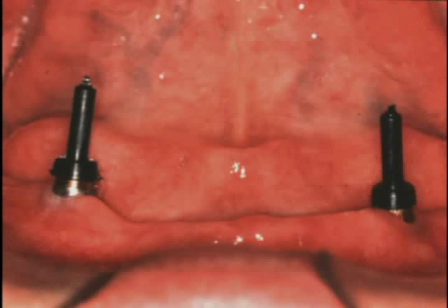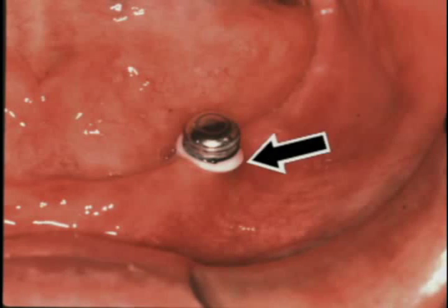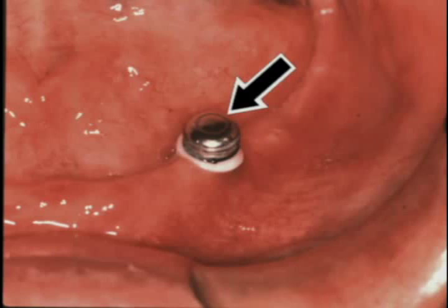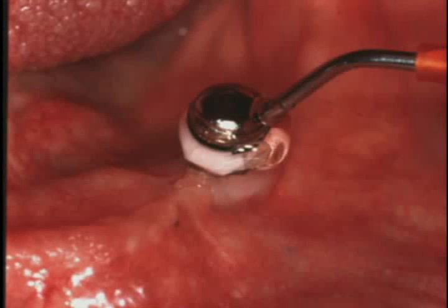When placing multiple attachments, snap a parallel post into each seated locator abutment to check parallelism between implants. For this patient, the locator male was placed into the overdenture using a chair-side procedure. First, a white blockout spacer was placed over the head of each locator abutment. Then, a locator cap with black processing male is snapped onto each locator implant abutment, leaving the white spacer beneath it. Recesses were prepared into the denture base to accommodate the locator males. Light cured acrylic resin was injected around the metal cap of each processing cap male, or through the access hole in the denture.